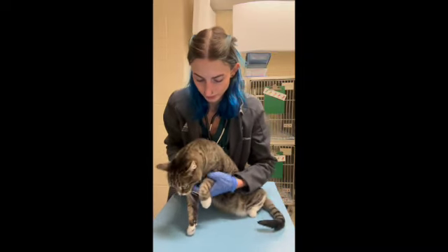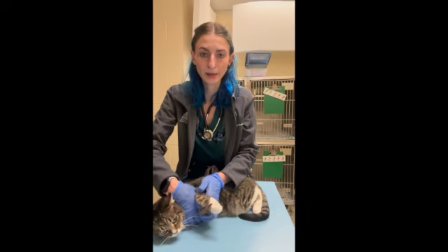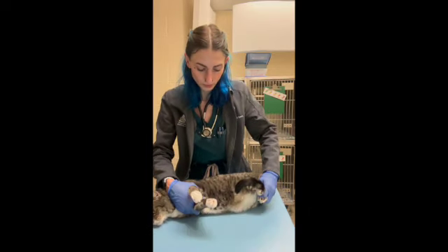Good girl. And we're just going to put her in lateral. And then what I'm going to do is take my hands and grab both sides of her limbs at the elbows, and I'm going to lay her in. This is going to be a right lateral recumbency.